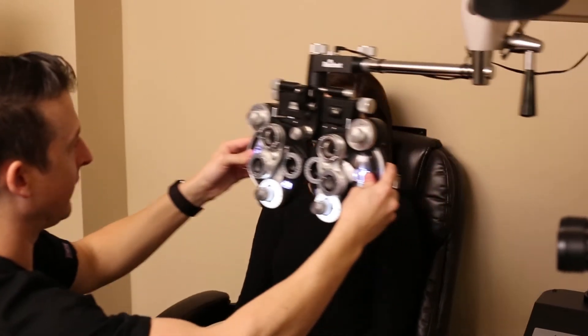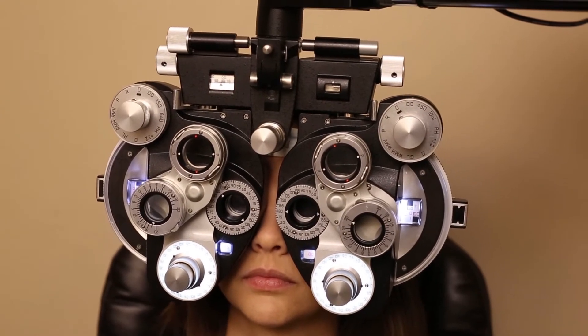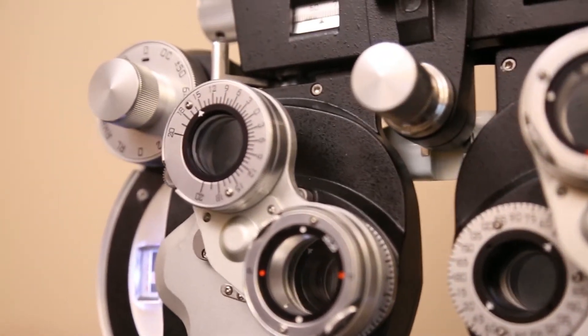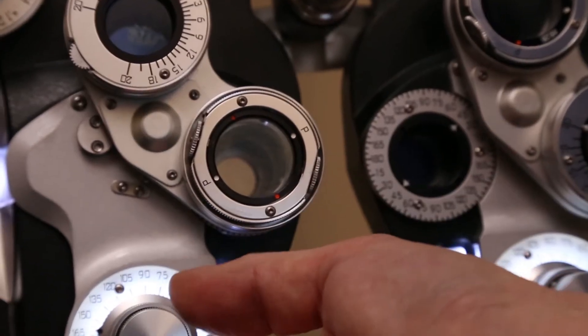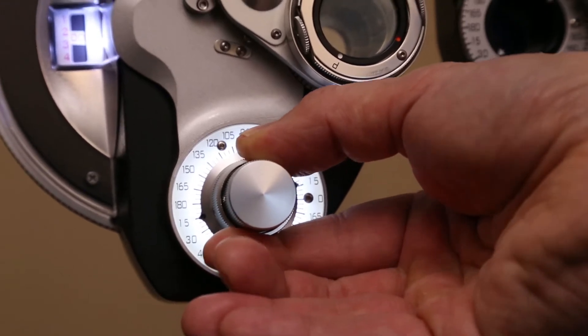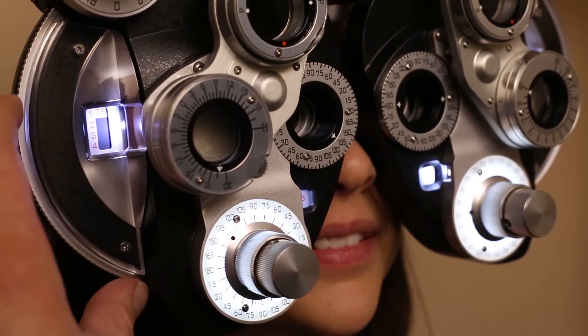To figure out someone's prescription for glasses, we need a phoropter. And this is a phoropter. It was invented a hundred years ago, and it's so good at figuring out a glasses prescription that we still haven't figured out a way to do it better. Over the next few minutes, we're going to look at what it takes to use a phoropter to do a refraction — turning knobs and dials to transform these lenses into the exact lenses your patient needs for a perfect pair of glasses.